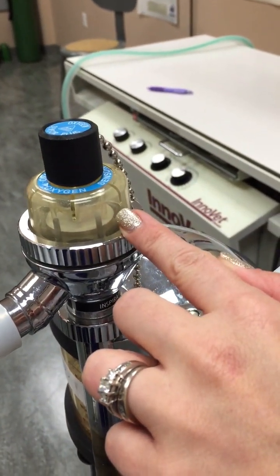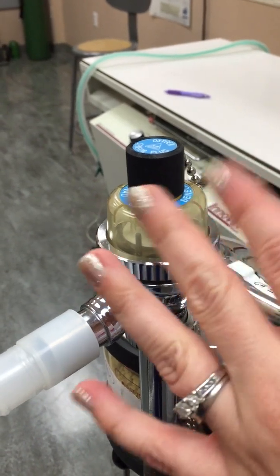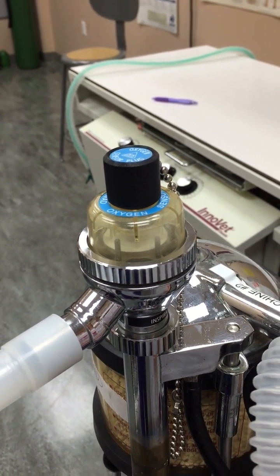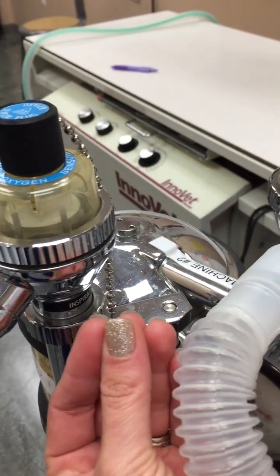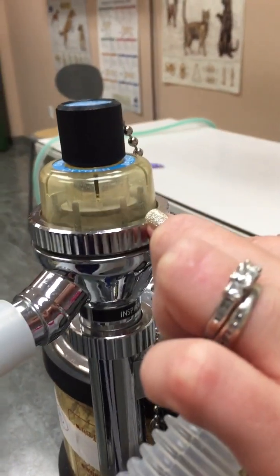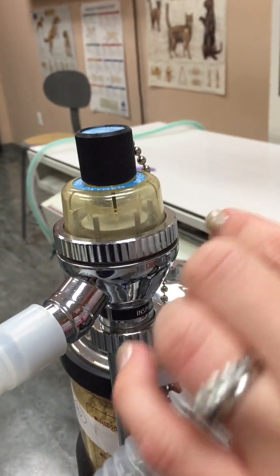What that means is these are unidirectional valves, so they will only open when your patient inspires, and it prevents backflow of oxygen and isoflurane. From the unidirectional valve, the patient breathes in, this flutter valve will lift up. I'll demonstrate to you if you watch right here. Okay, you can see those flutter valves move.